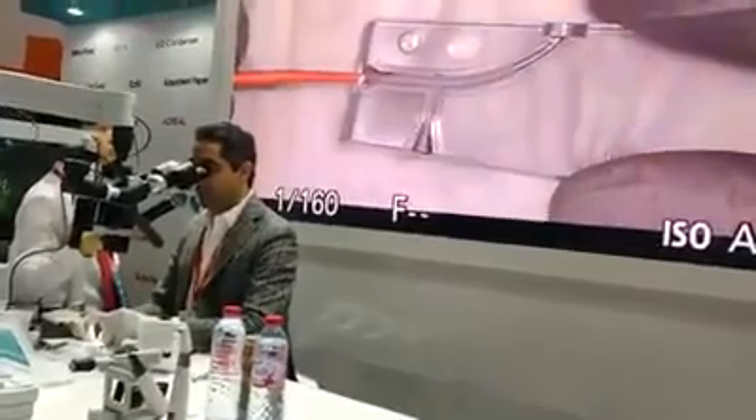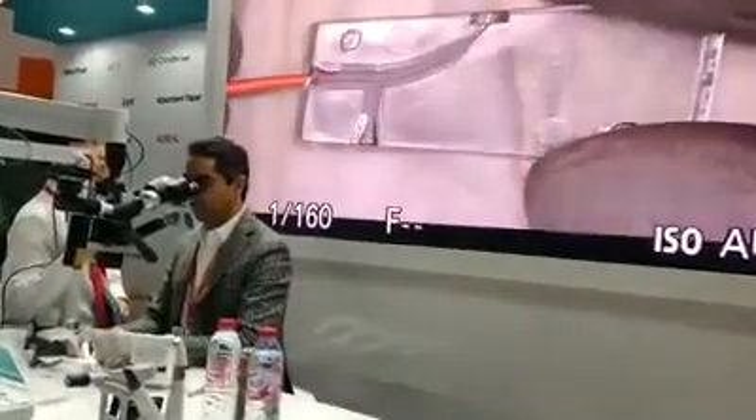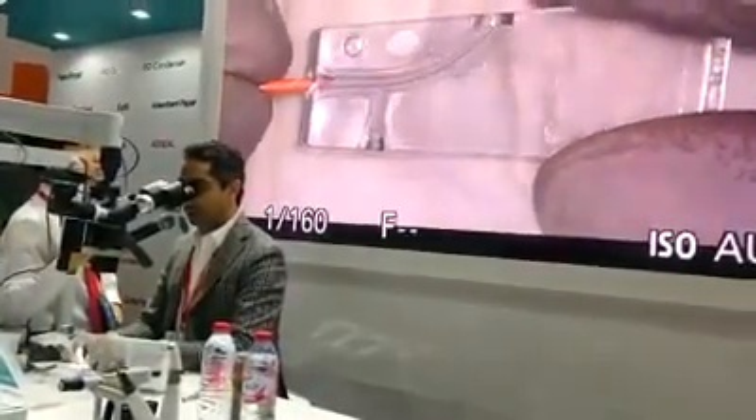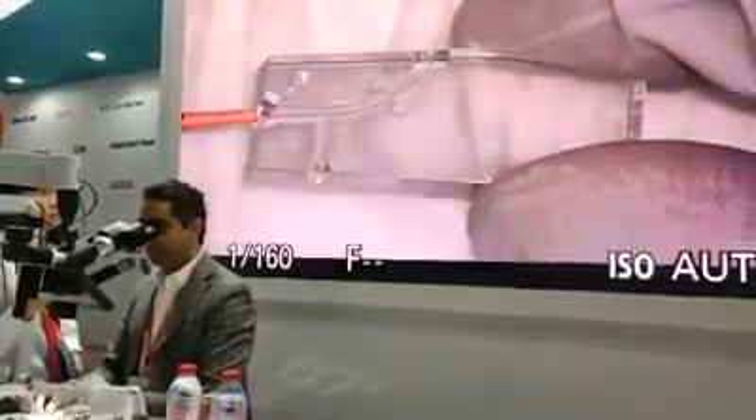Now I will put my master cone — as you can see, the sealer is going everywhere so smoothly. Can you see the lateral canal here? Here is the lateral canal filled with TheraSeal.